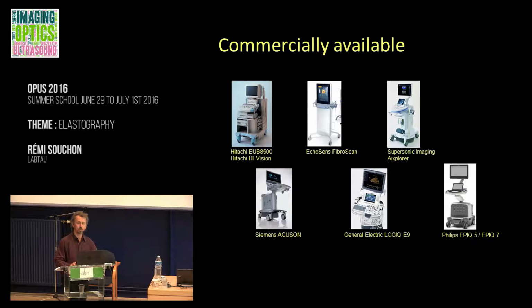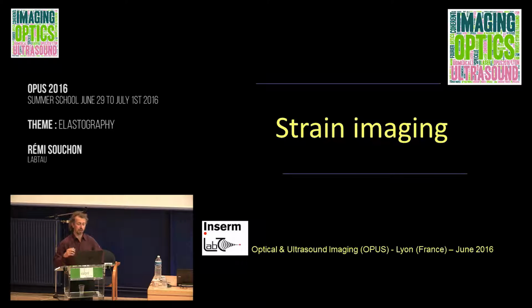The two major techniques are strain imaging, and you saw some strain images from Karin. But we also have additional techniques that go into quantitative elasticity imaging, whereas strain imaging will only be a relative measurement of stiffness, the shear wave imaging will provide us with quantitative measurements.